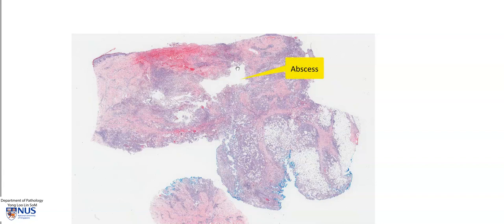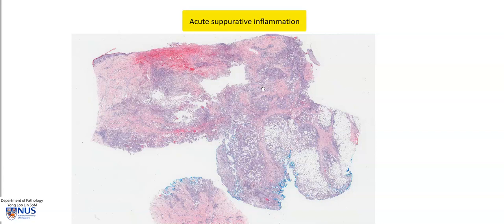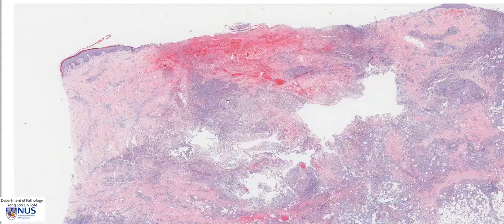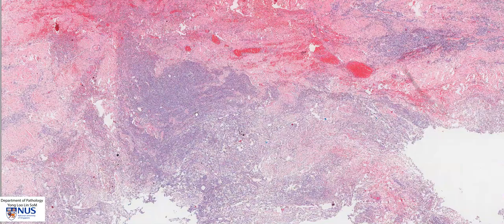We can see that there are large areas of bluish cellular infiltrates within the dermis, also an abscess cavity forming here, and these bluish cellular infiltrates extend deep into the subcutis. All these are areas of acute suppurative inflammation. There is also a little bit of hemorrhage here, potentially due to the trauma of the surgical procedure. Let's have a closer look at these bluish cellular infiltrates.